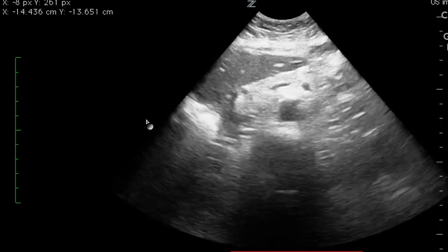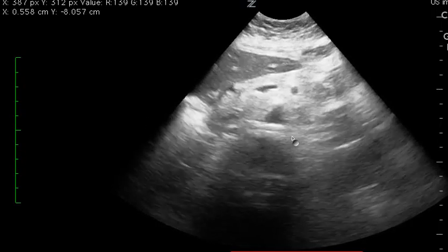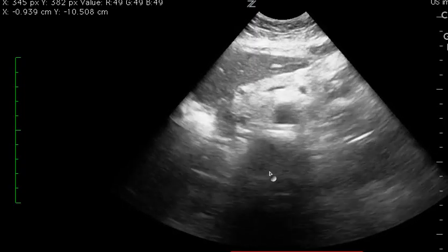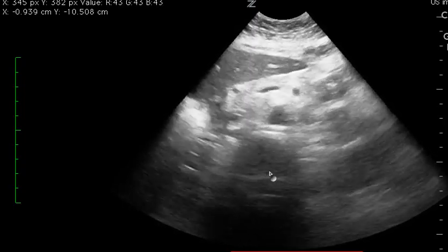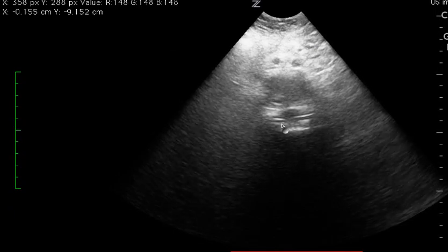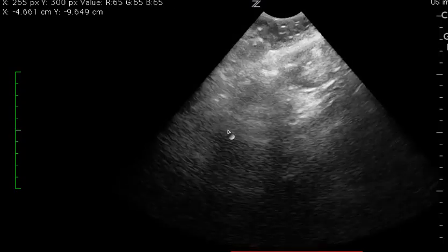Because I think this is a normal aorta — you have a great view here — but I don't see the bifurcation, and I think one of the reasons why I don't see the bifurcation on any of the clips is because it was probably seen but never completely saved. Same thing with the FAST exam: I can't make a clinical interpretation only because most of the images, as I illustrated, are you taking a look briefly and then all of a sudden it just goes away.